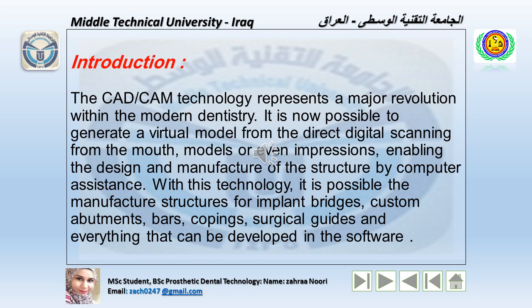The CAD technology represents a major revolution within modern dentistry. It is now possible to generate a virtual model from direct digital scanning of the mouth, models, or even impressions, enabling the design and manufacture of the structure by computer assistance. With this technology, it is possible to manufacture structures for implants, bridges, custom abutments, bars, copings, surgical guides, and everything that can be developed in the software.